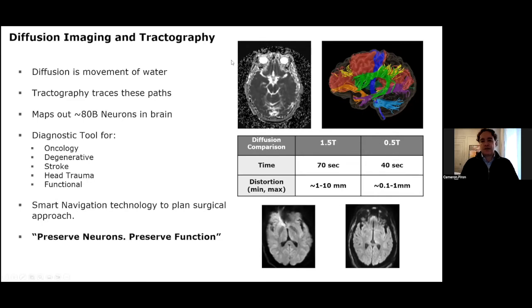And there's this modality or method of imaging called diffusion imaging. It's basically the movement of water molecules throughout the body, and the signal that you get from MRI comes from water. It's the most plentiful substance in the body, and there's a really unique way to image it that lets you actually visualize the movement of the water. When you do that, you can create these traces in the brain, so you can image these connections within the brain and image the tracks.